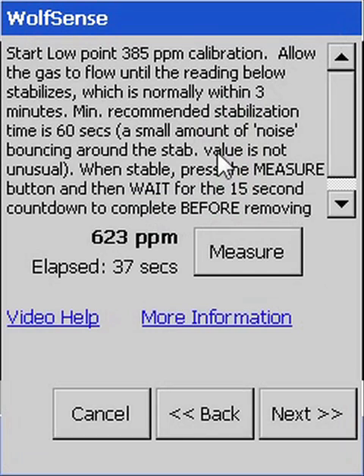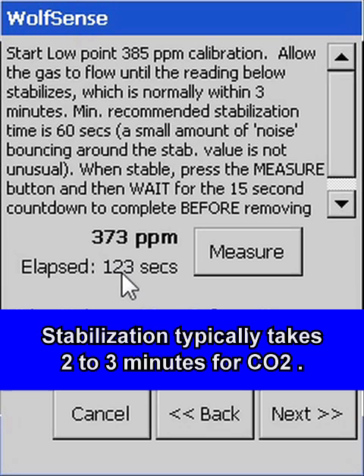Once the reference gas is flowing, allow time for the reading to stabilize — two to three minutes for most gases, including CO2, but as much as six minutes for some others, which will be indicated by the software.